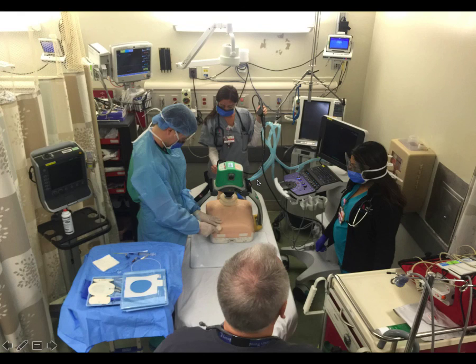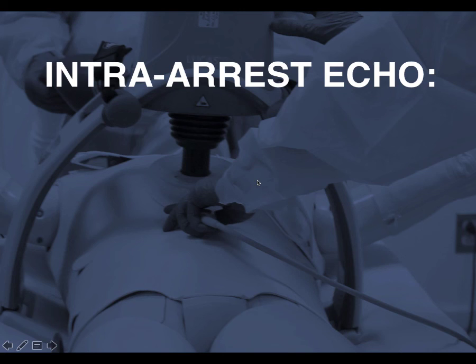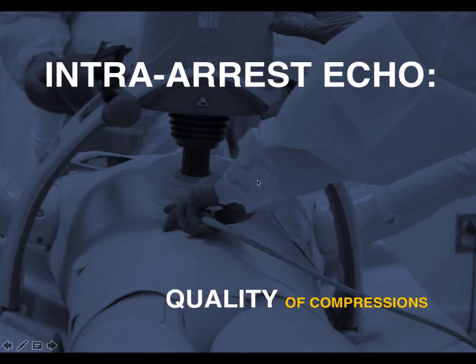Immediately after the patient is intubated, the airway person moves. The patient is hooked up to a ventilator, and the person that is doing TEE will get on the head of the bed. As you see here, the screen of the big machine is facing the team, so the entire team can be looking at that as a continuous window to the ongoing resuscitation throughout the entire code. If you have only a transthoracic echo, you should probably place the machine on the left side to be scanning from the left side of the patient.